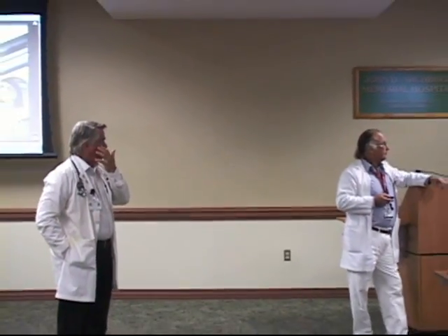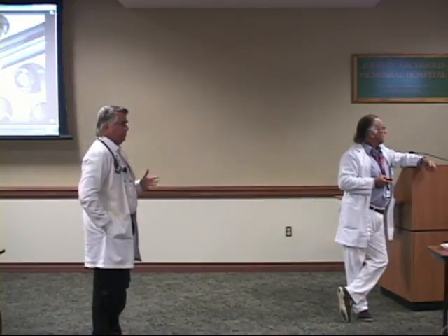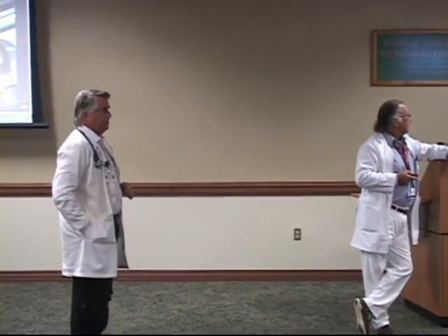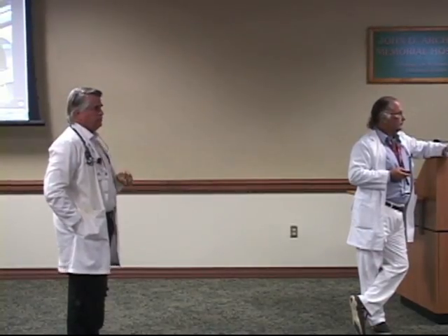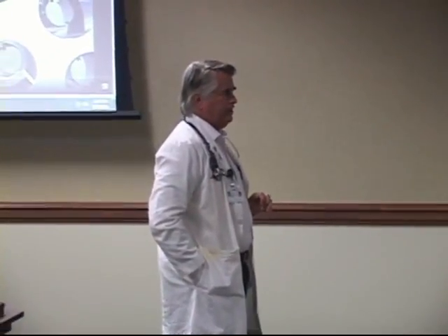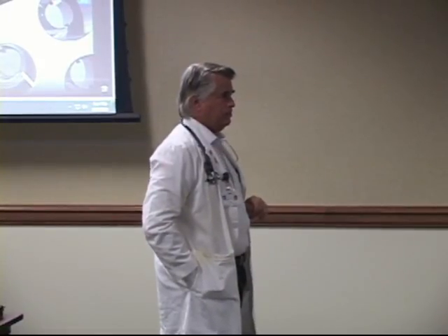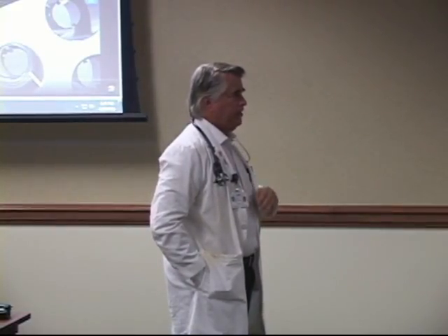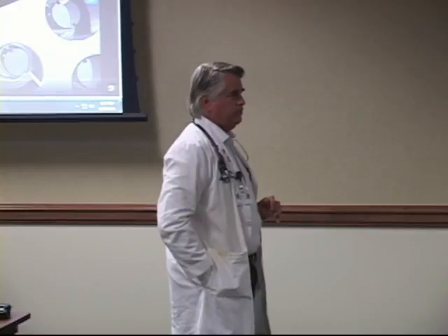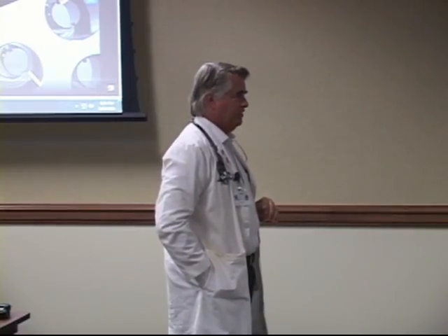Can you treat the lungs? Yes. With the SBRT, we can, for the patients that can't undergo surgery, they may have COPD and can't tolerate surgery, we have about a 90% control rate treating any tumor that's less than about 4 centimeters, 3.5 centimeters or so. It's very high control rates, and it's only 4 treatments instead of the usual 6 or 7 weeks of treatment you hear about. So that's a huge technology for us. We have a lot of lung cancers down here, a lot of smokers.